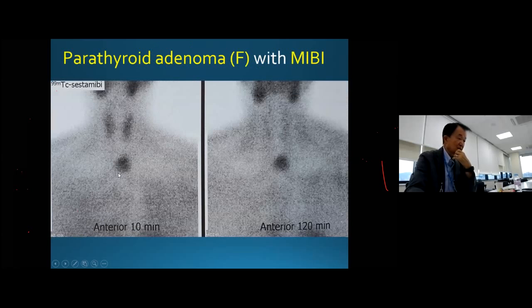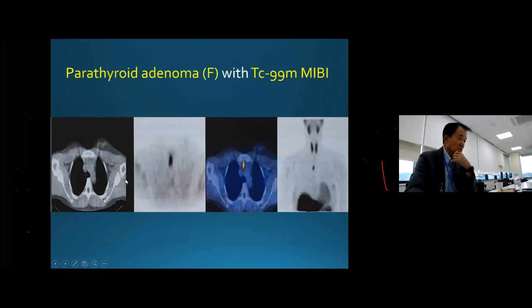Okay, some fall down into the superior mediastinum. That's called F, right here. In this case, the endocrine surgeon or general surgeon asks a thoracic surgeon to join and open up the superior mediastinum. And on this, see way down here, it's the anterior mediastinum, focal.